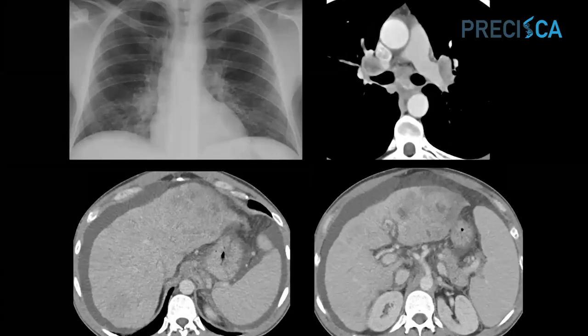In the second case, we have an adult patient who also had embolic disease to the pulmonary arteries. And here we can see that there are areas of enhancement. It looks very similar to the subcarinal lymph node. It looks very similar to the patient's parent tumor, which was hepatocellular carcinoma. A good reminder that hepatocellular carcinoma can embolize to the pulmonary arteries, and these intra-arterial metastases can enhance. They tend to look very similar to the parent tumor.